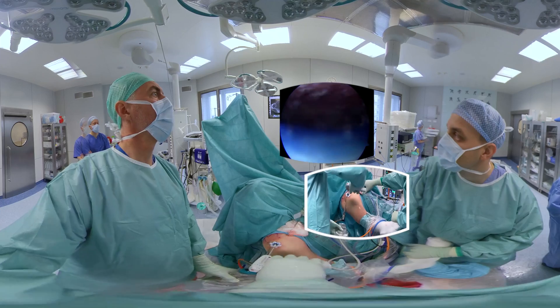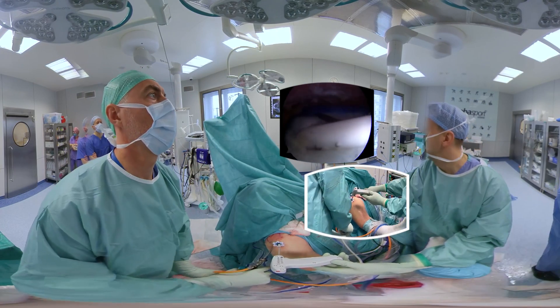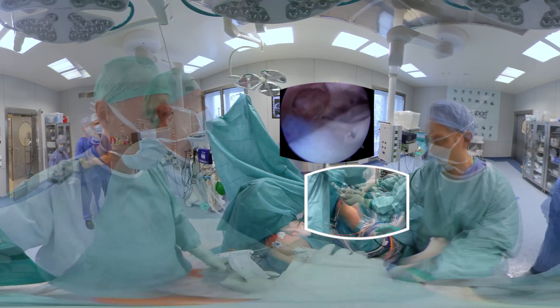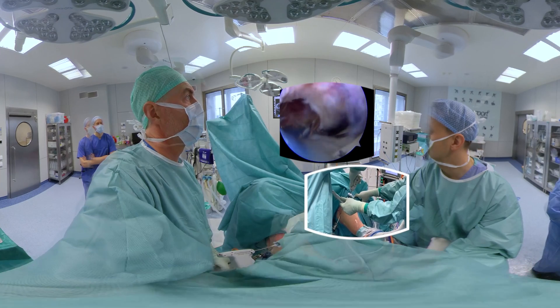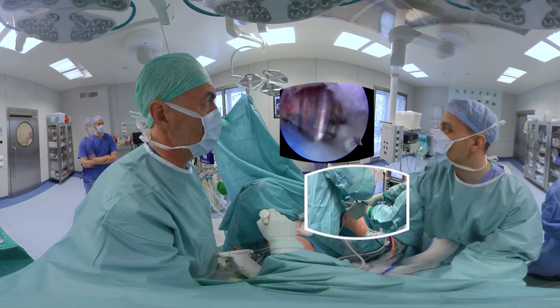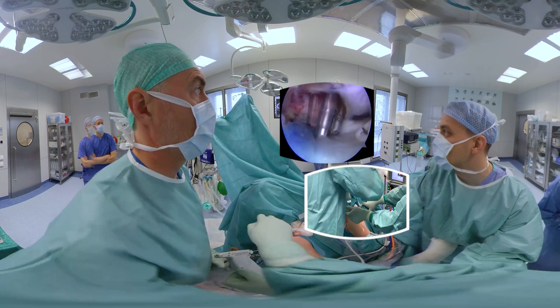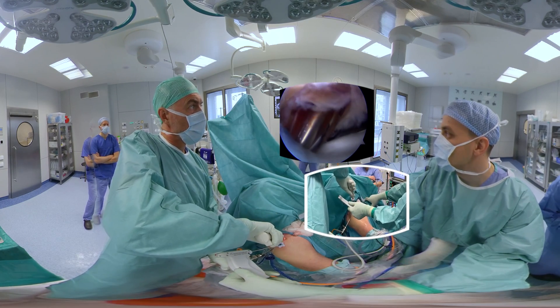At least the lateral 5–7 mm of the implant needs to extend laterally and stay on the bone. An additional narrow transparent cannula from the set is used from the anterior superior portal for stapling the membrane. For that we use a tendon anchor inserter that applies absorbable staples. Typically 5–6 staples are used to fix the membrane to the tendon.